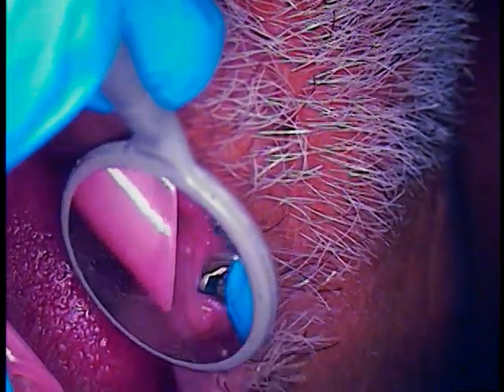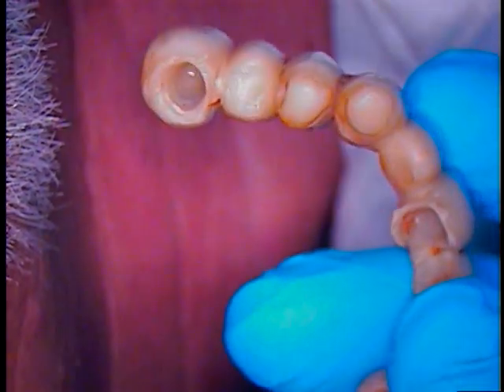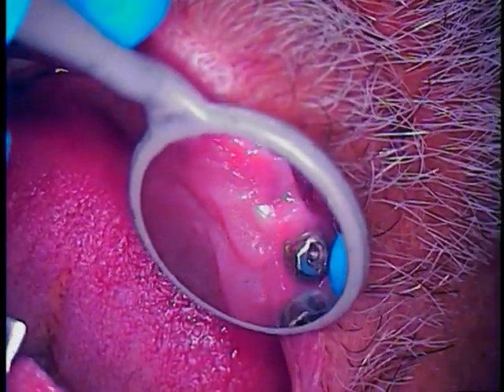He is planning to convert a full reconstruction case upper to that of a hybrid. Right now the patient was wearing this temporary bridge that was made for him as an interim prosthesis, and now we're here to rescue implant number six.